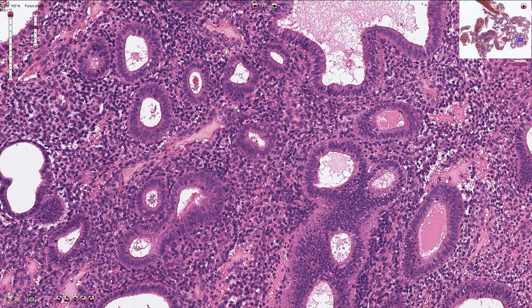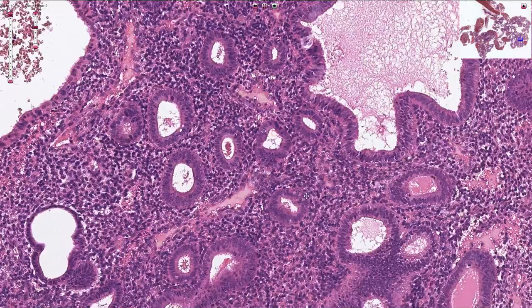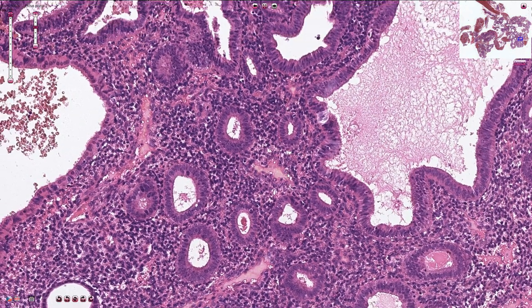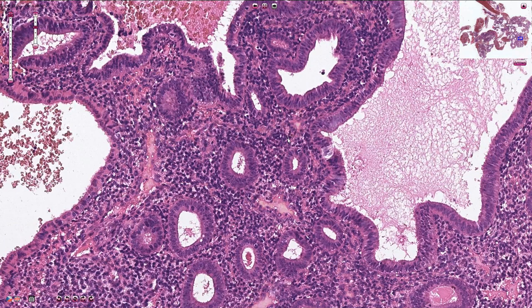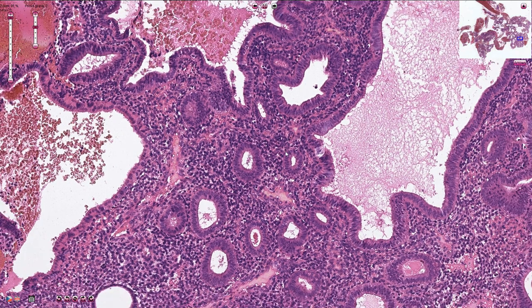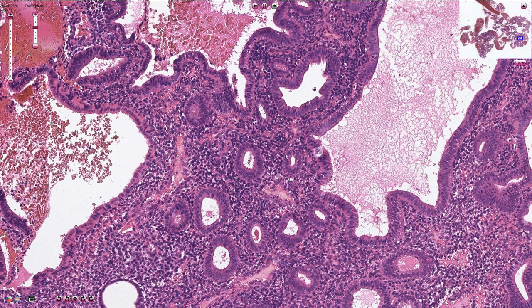There are no cribriform structures or back-to-back glands, which can sometimes be seen in atypical hyperplasia or endometrial intra-epithelial neoplasia according to the new nomenclature.